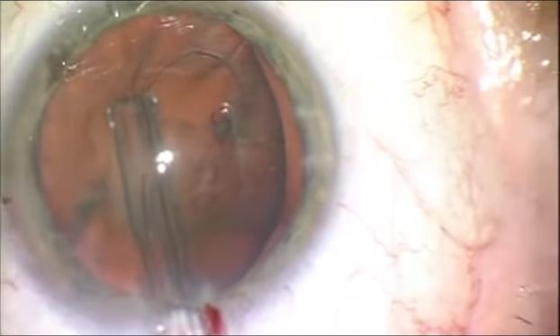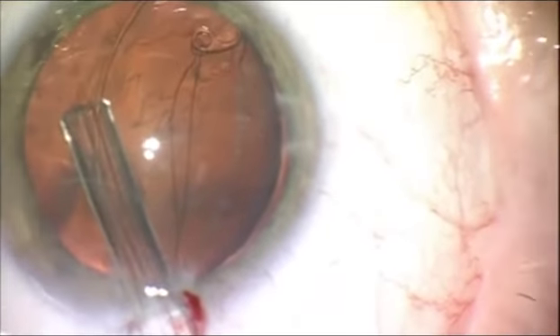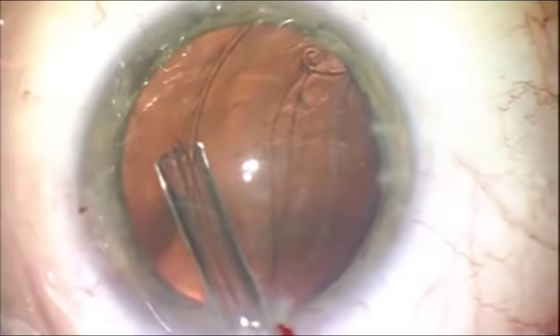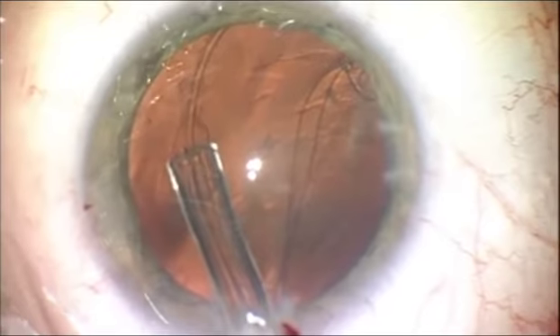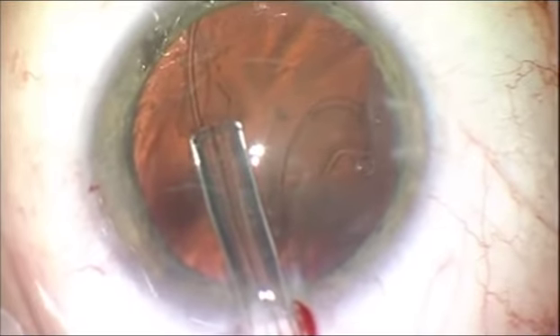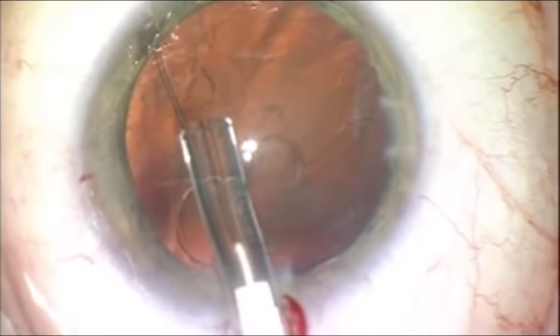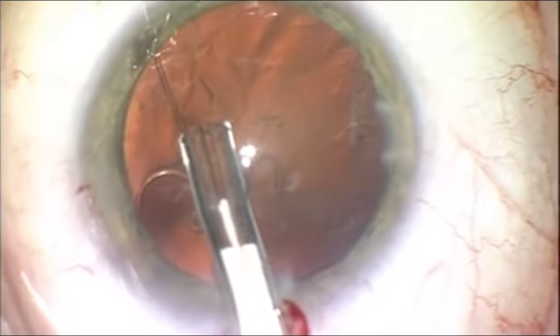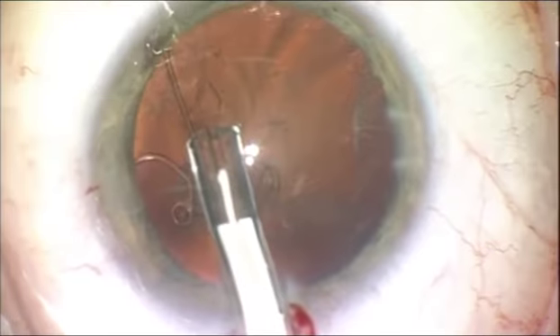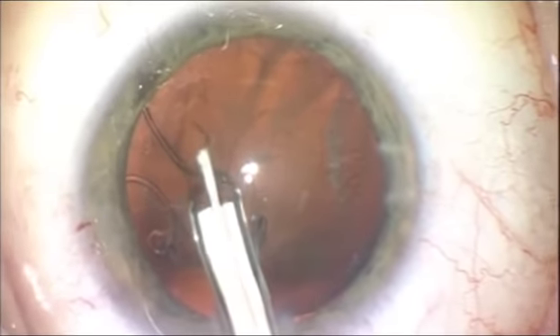During surgery, CTR is injected in the direction of the zonular defect. In that case, remaining zonular apparatus will help to stabilize the whole capsular bag. You see how easily the CTR is sliding along the equator of the bag, and now the trailing eyelet will be released to place the device completely inside the capsular bag.